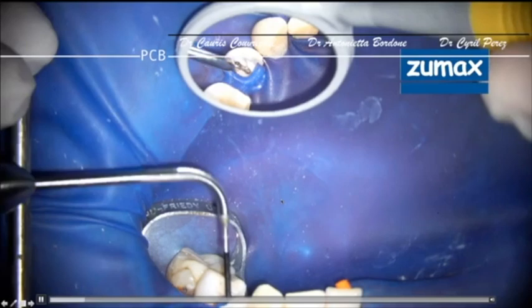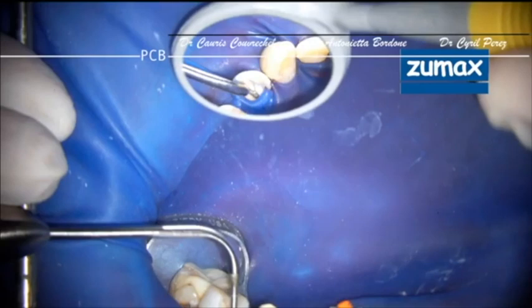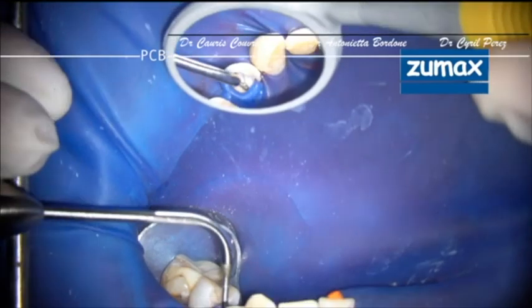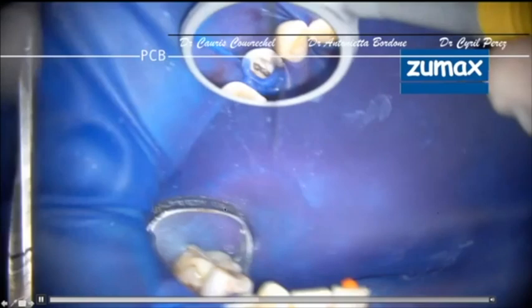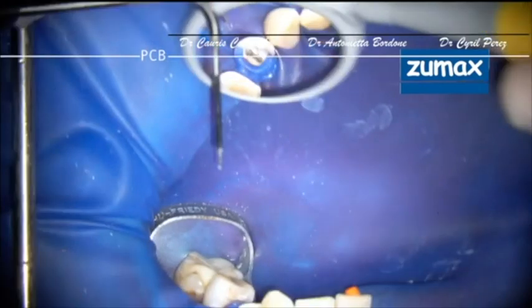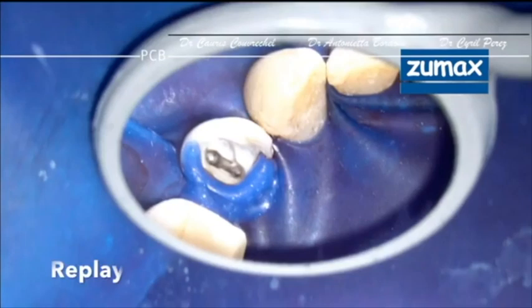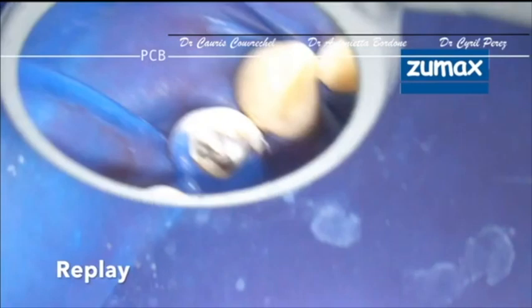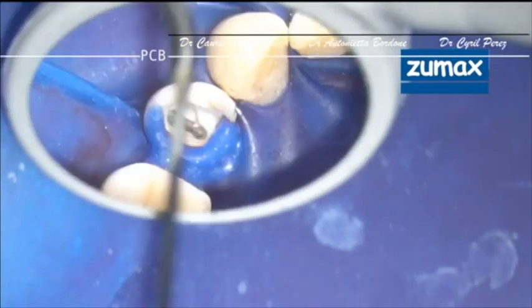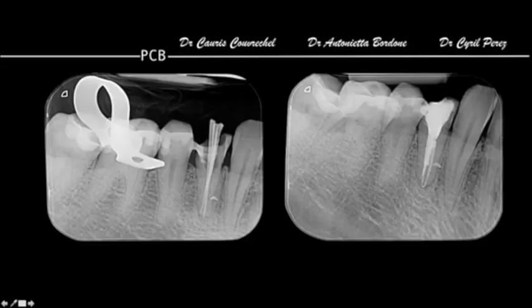This is the video using the extractor after using the trephine of Zumax. We are trying to retrieve it with the extractor. When the extractor catches the file, it blocks. It will not release it unless you unscrew the extractor. So here, when it catches, it becomes very tight, and sometimes you'll use both hands to retrieve it.